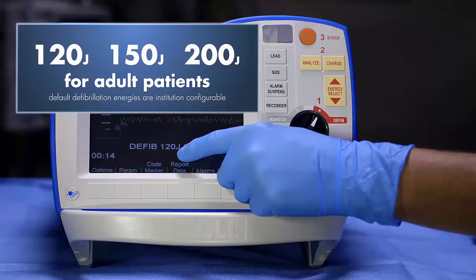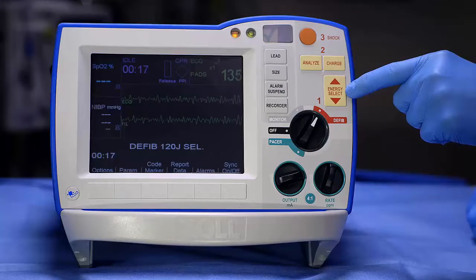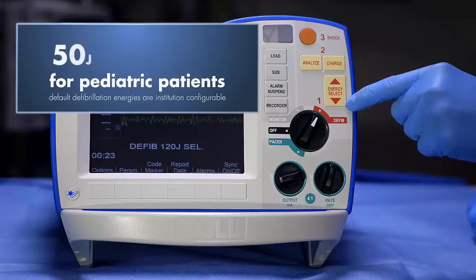ALS providers can change the energy setting manually by pressing the Energy Select button up or down. The defibrillation energy protocol for pediatric patients is 50, 70, 85 joules.